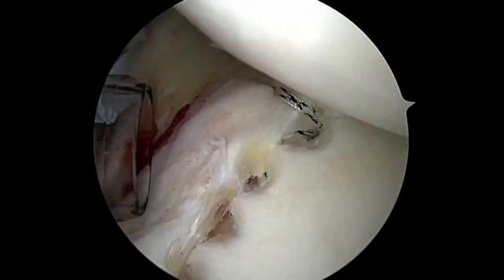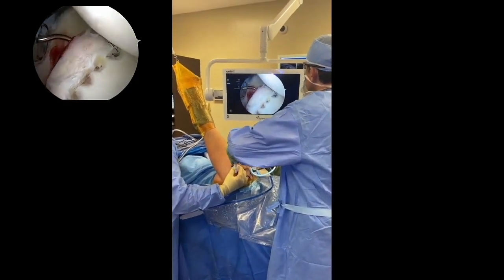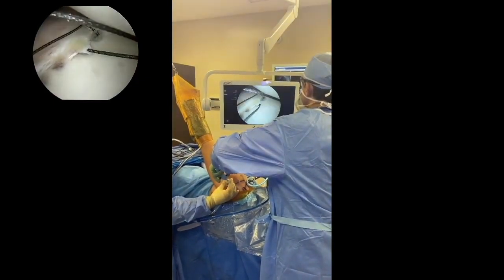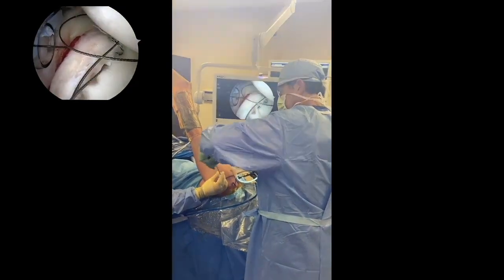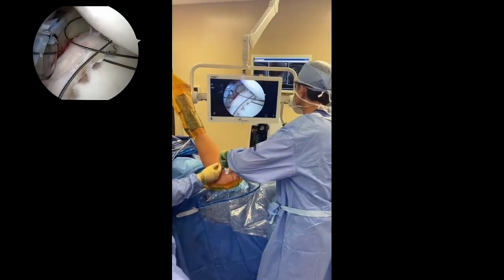The suture is cut as flush as possible so that we don't have a tag of suture which can rub against the articular cartilage. Here we're visualizing the technique from outside of the shoulder. We're going to shuttle in as much of this wire as possible into the joint and then continue to deploy it when we pull out the instrument.